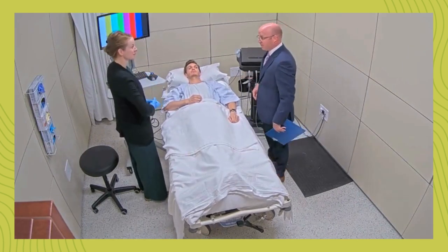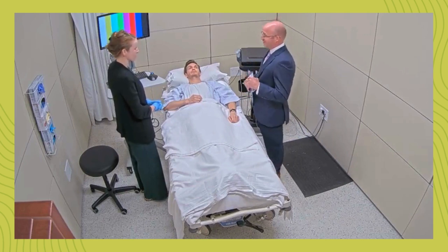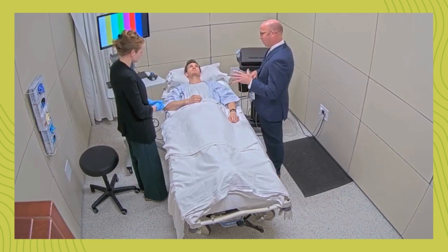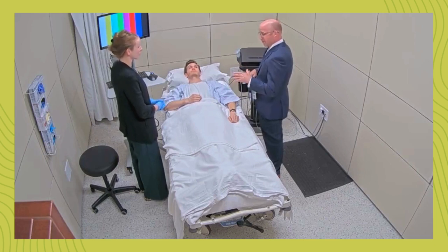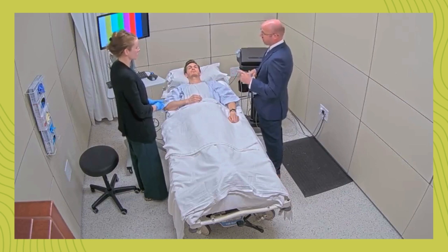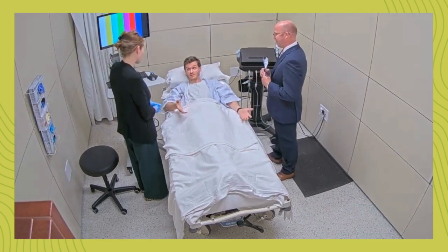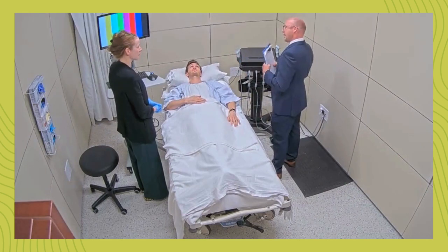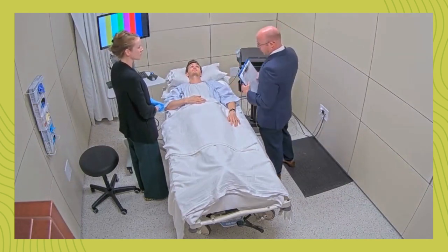So this is your patient. He's a 37-year-old gentleman with a history of IV drug use. He's coming in today complaining of right lateral thigh pain and redness that's been going on for the past three days. Vital signs when he came in: a little hypotensive, a little tachycardic, with a low-grade fever. Your nurses have tried multiple times to place IVs. What I'd like you to demonstrate now is how you would use ultrasound to place a peripheral IV in the patient's right upper extremity.